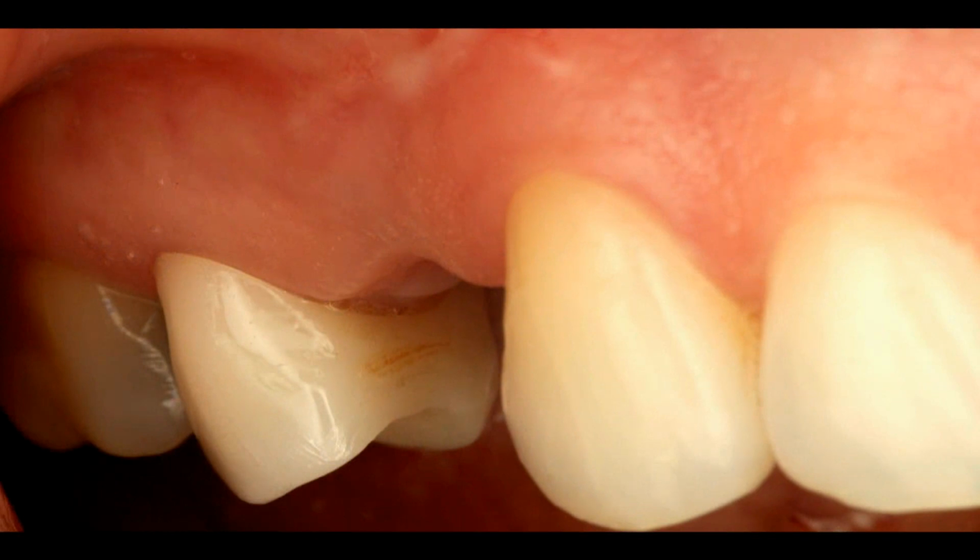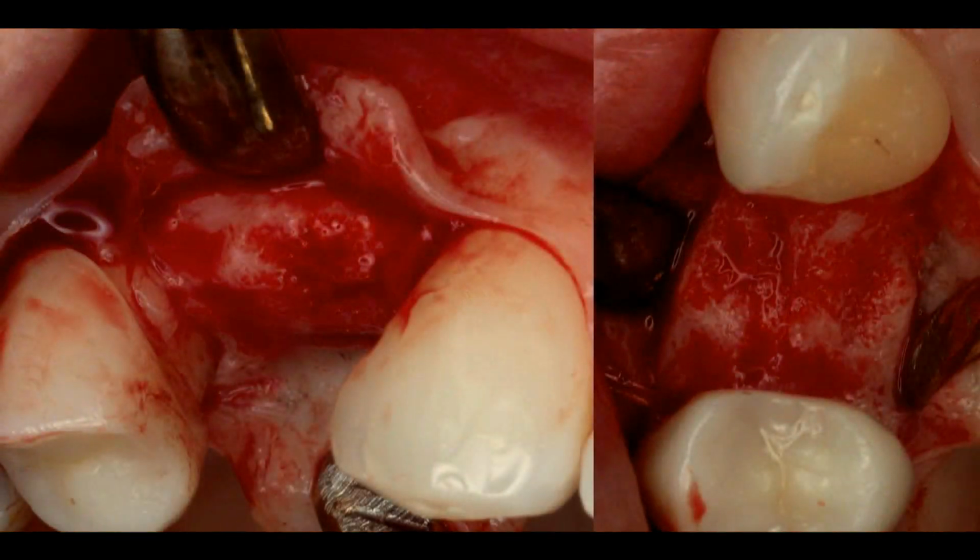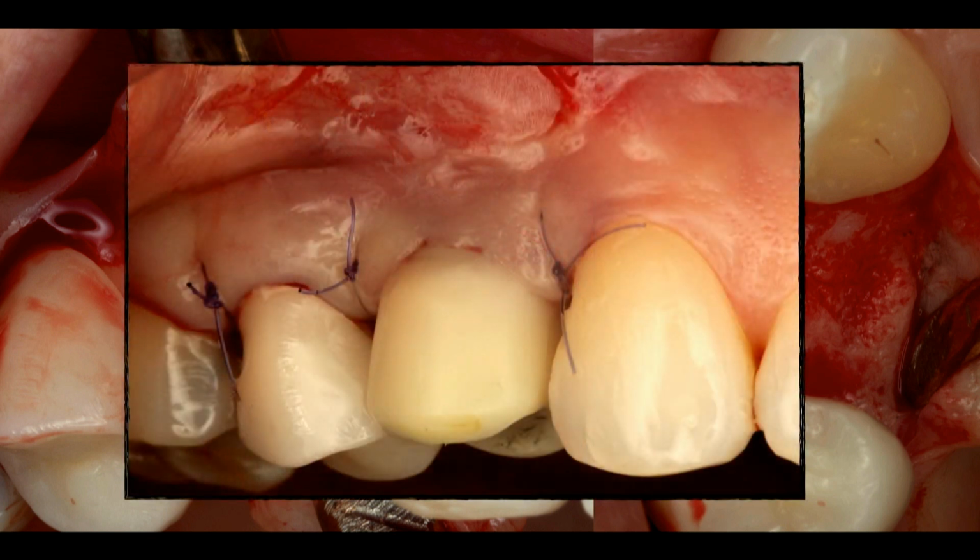We do have a little scar up here, which I'll take any day of the week. We'll flap this open to place our implant. I don't do things flapless very often. So we did this with a small little flap, great bone, great bulge of that buccal plate, that buccal occlusal line angle. Was able to place our implant and even immediately load that implant.